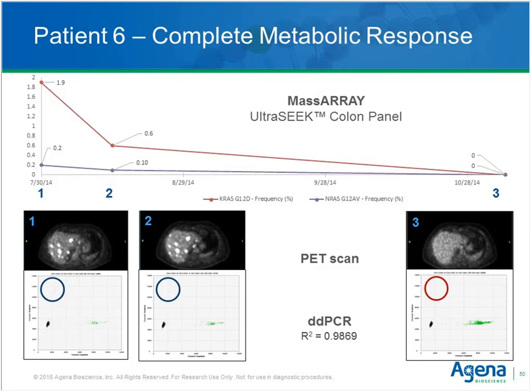Comparing these liquid biopsy findings to the imaging, which are the two images in front of the black background, number 1 and 2, you barely see a difference in the images, whereas with liquid biopsy we could already see an effect of the treatment. So this dynamic is simply missing in the imaging, in the PET scan, and only at the third time point could you also see that there was no tumor detectable anymore. So that's confirming the liquid biopsy.